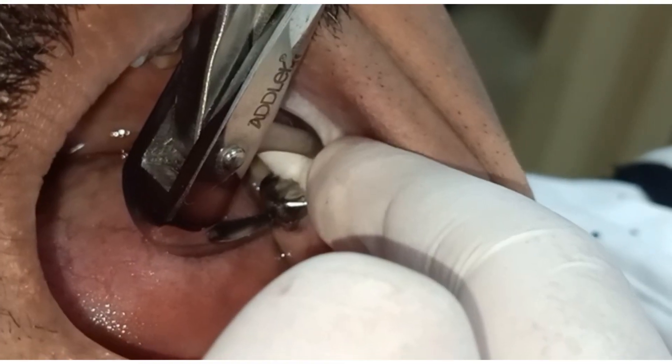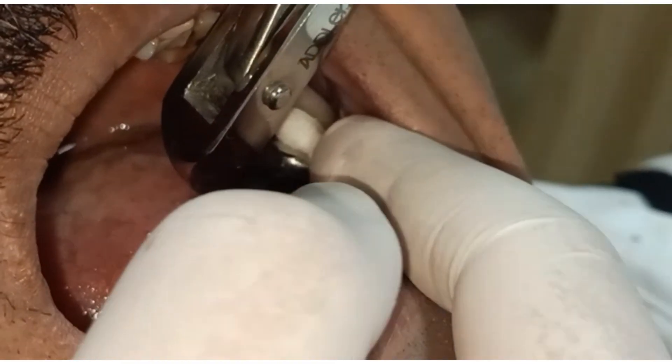In case you are doing mandibular, hold it in reverse and try to pull it up.